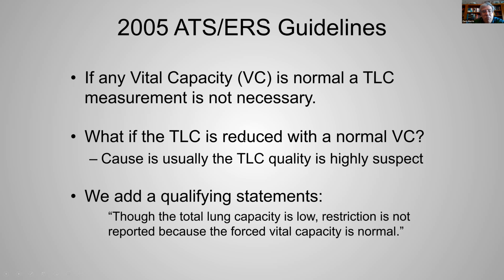Now, what about the converse situation? What if the TLC is reduced with a normal vital capacity? What I'm going to show you is that usually when you see that scenario, and we do see it pop up every now and then, people want to erase the interpretation on the computer and say this is restriction. The cause is usually that the test quality of the TLC is highly suspect. I'm going to show you why that is in a minute. That's the majority of the reasons you see that.